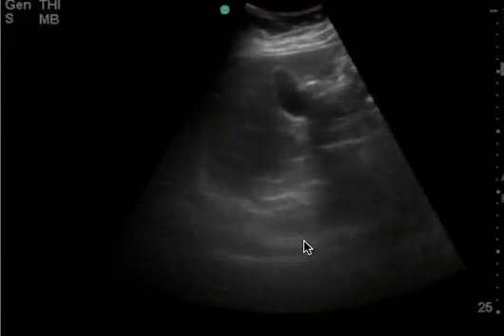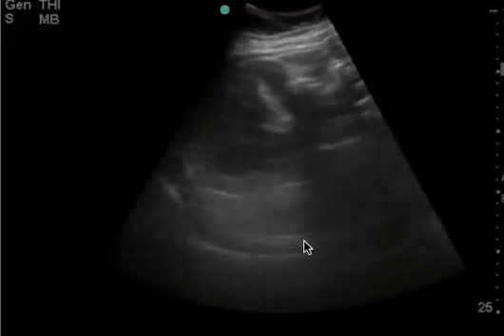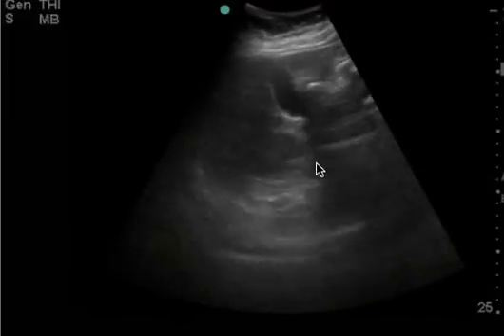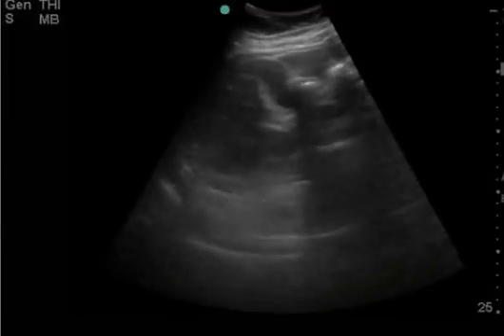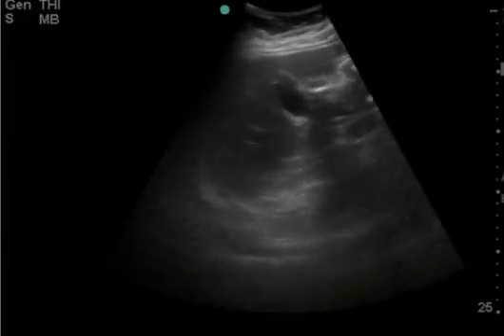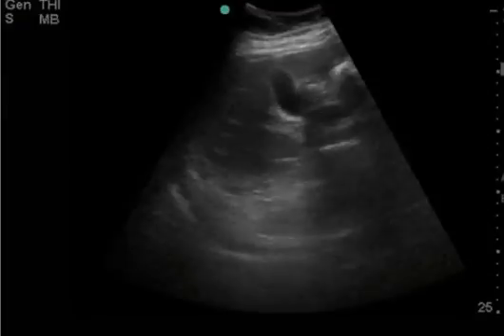And so the computer, the ultrasound machine, has trouble really focusing on the gallbladder and is trying to focus on the entire region, which is why it's difficult to see everything that you need to see. And so because of the issues with the depth, the ultrasound is technically limited.